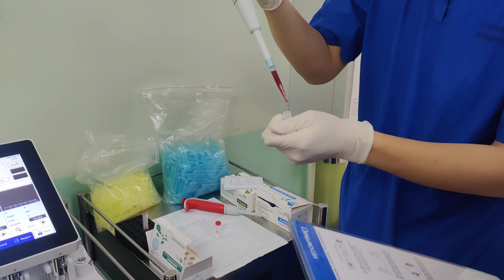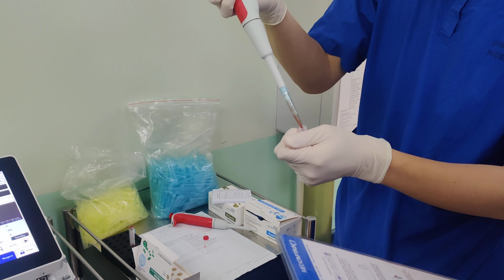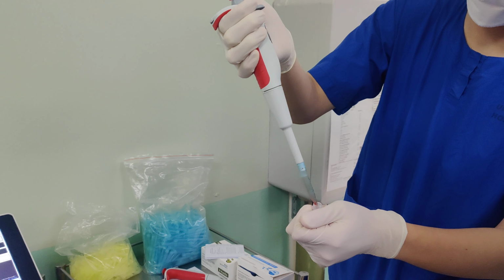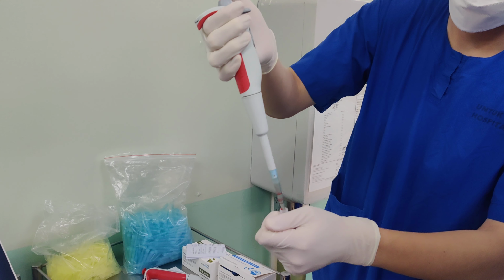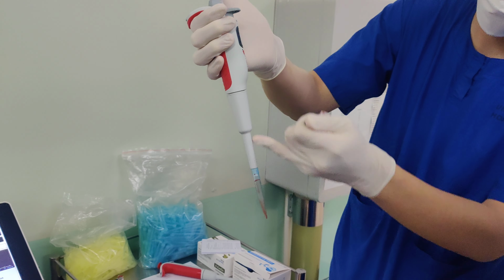Okay, so same like just now, we just press. This is how to press. We just press to the first stop, then it will release. Then when we put that up, do it slowly, because if you immediately let go, the blood might shoot up to the back.